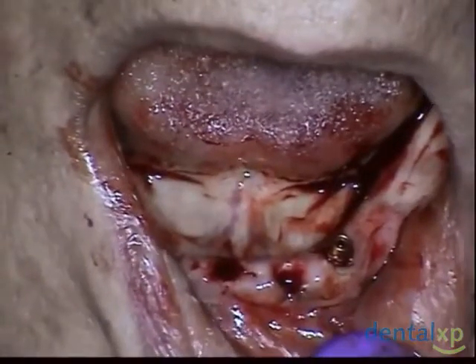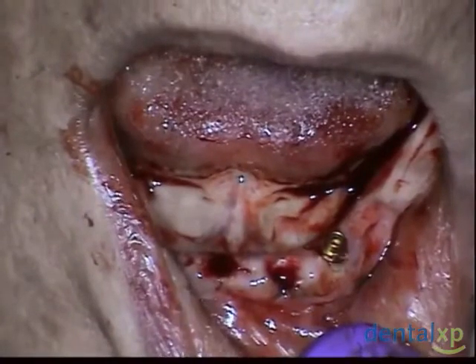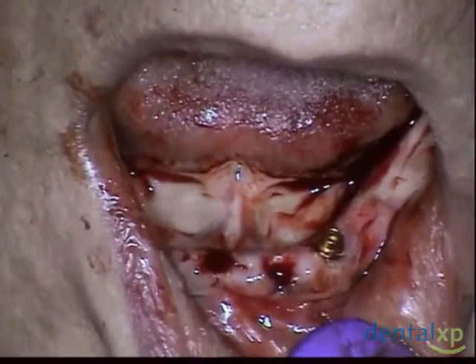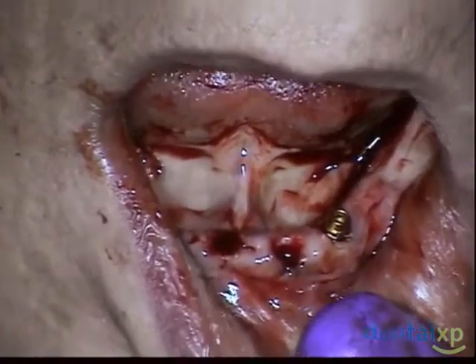So did I need to do it? In my opinion, I probably did. Well, I would do it anyway. So now, as I was so kindly reminded, I'm going to go down and do the same thing on these others so that I can get rid of the use of that 1.6 burr.